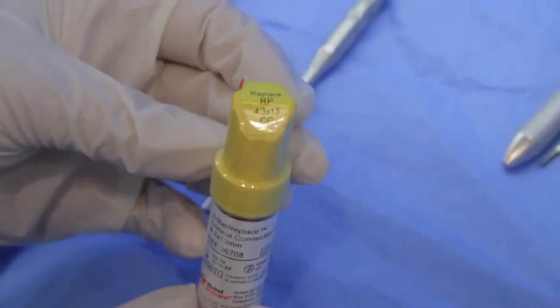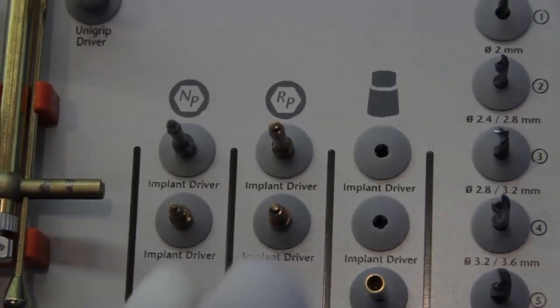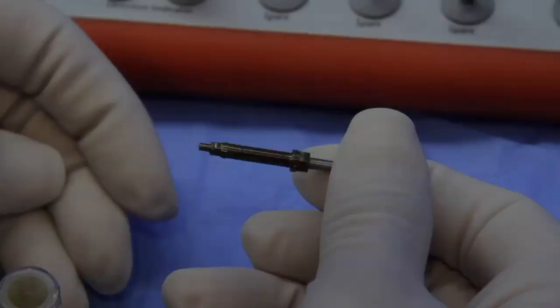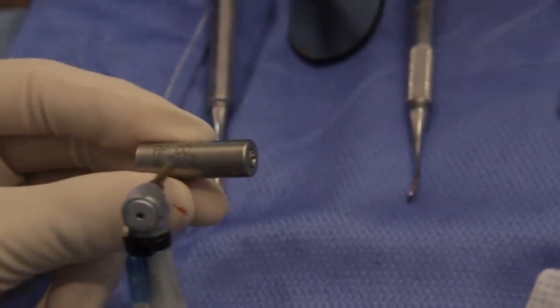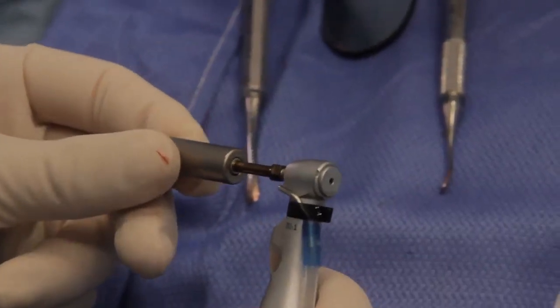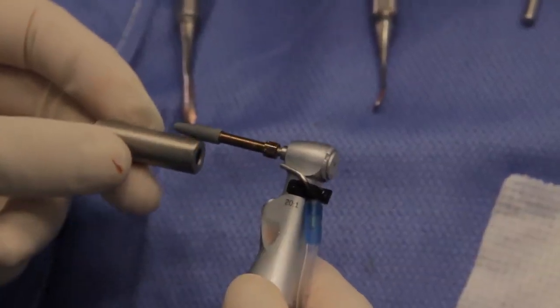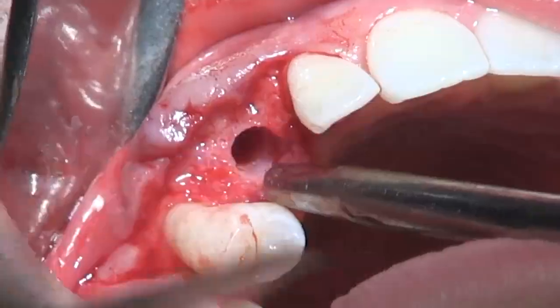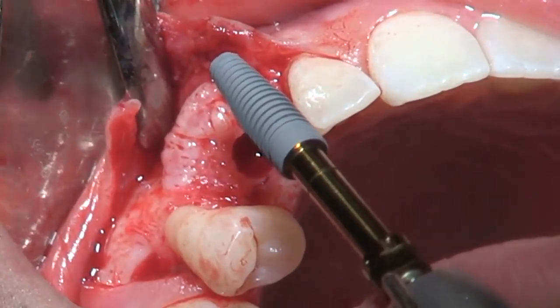We're using the 13 mm conical connection, tapered implant, a regular platform. A long shaft driver is being used, again to gain good access in between the adjacent teeth. The driver is picking up the conical connection implant from the titanium sleeve, and the osteotomy is being irrigated for the last time to remove any kind of final soft tissue, and the implant is ready to be inserted.